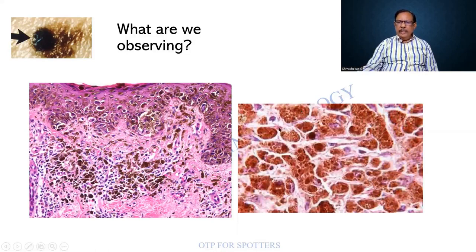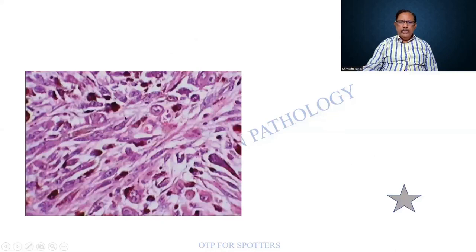So this is the intervening supporting tissue. Large cells, coarse granules, nucleus obscured. Look at this one. I am finding round cells. There is a prominent eosinophilic nucleolus. Also, there are elongated cells. Both of them are tumor cells, and I'm finding the brown-black pigment.